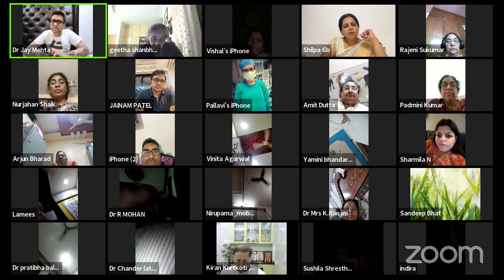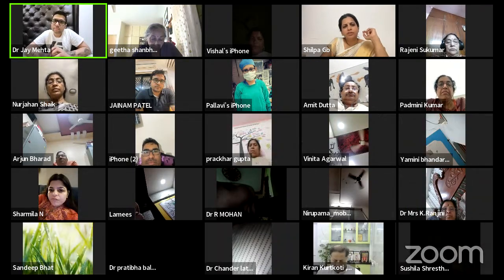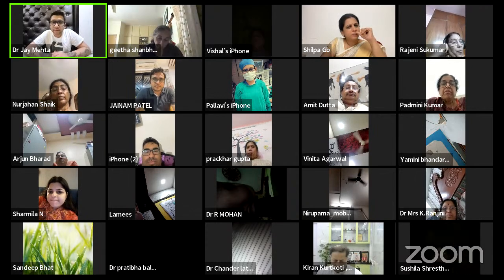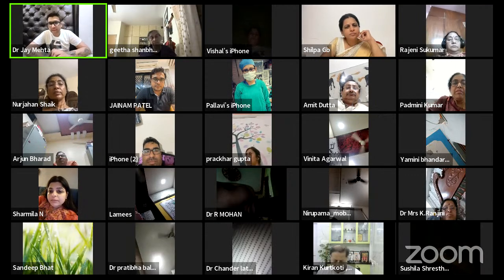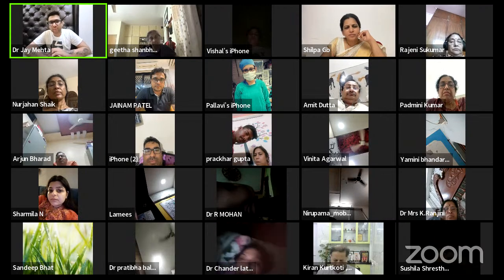So in your practice, the commonest finding on hysteroscopy for infertility is chronic endometritis? Chronic endometritis and Asherman, yeah. And that is purely related to the crowd profile which I am treating. That is not related to general practice. It is purely related to the crowd profile.